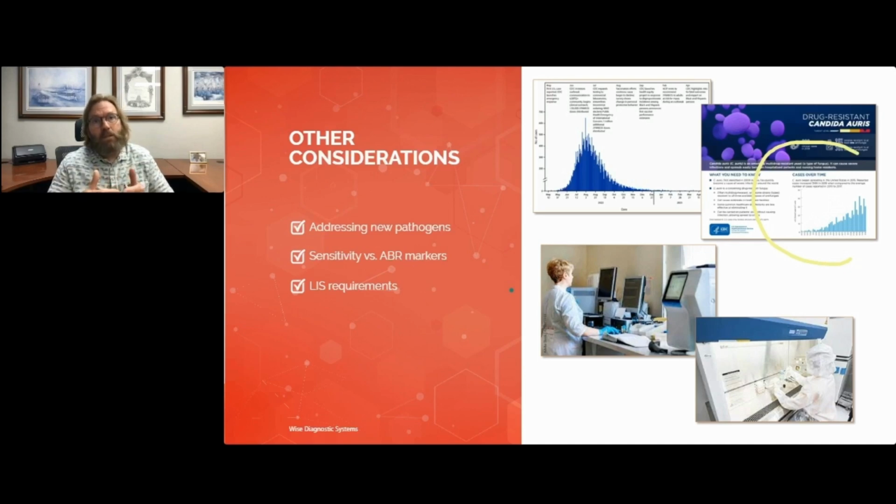So we did, in fact, bring on board the Candida auris in order to, again, add some value to the panel that clinicians were already using for wound care. And so it's just something to consider as you look to build your customized panels or bring on a pathogen potentially by itself.